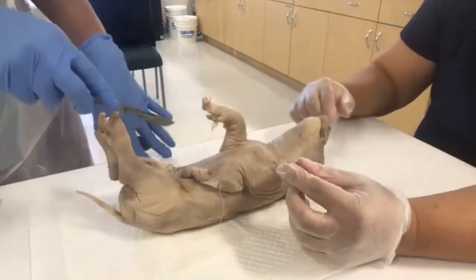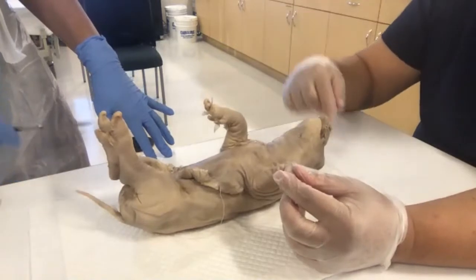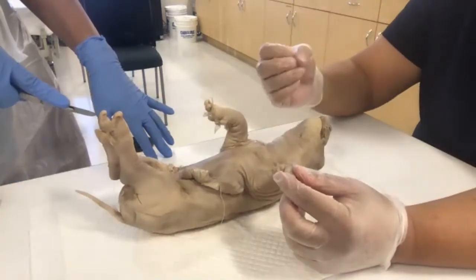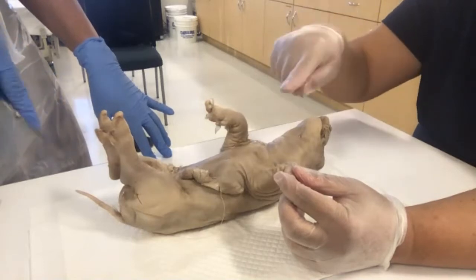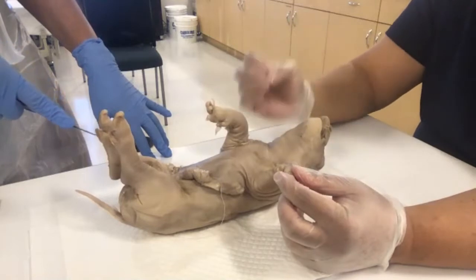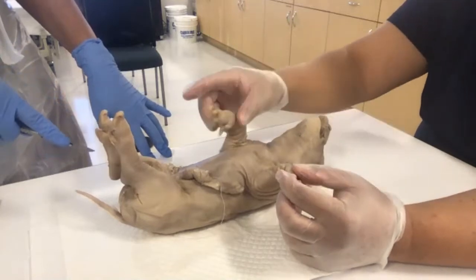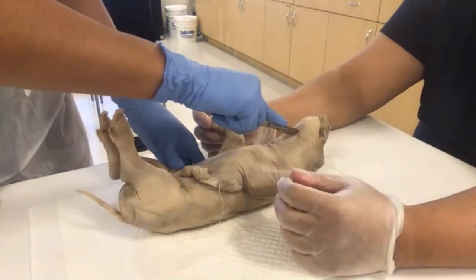Now, if you look at the way she's holding the scalpel, right? That was one way: she's using her second digit as kind of a guide, like pointing. The other way is to hold it like a pen. All right, so I'll be the assistant. So Ms. Brittany, first cut please.